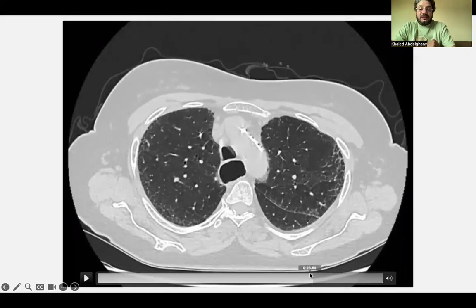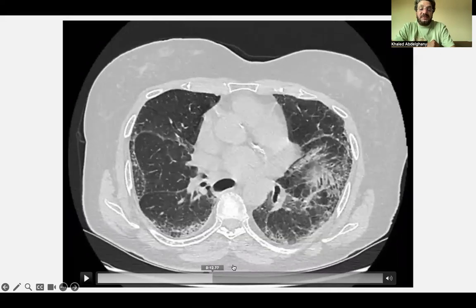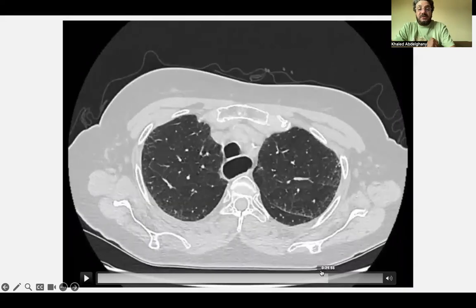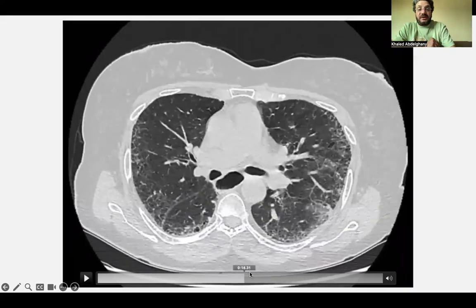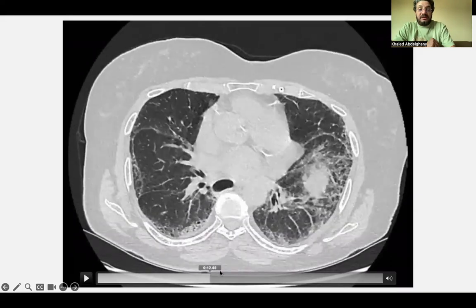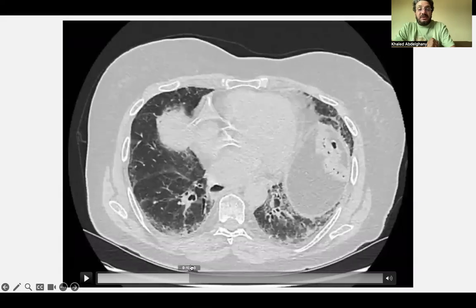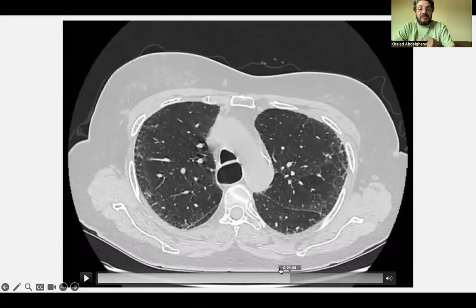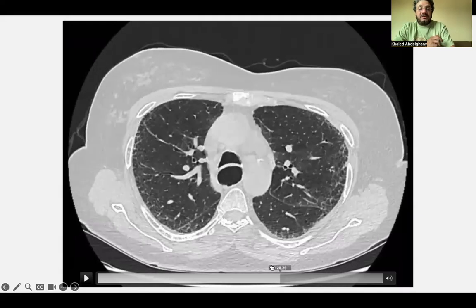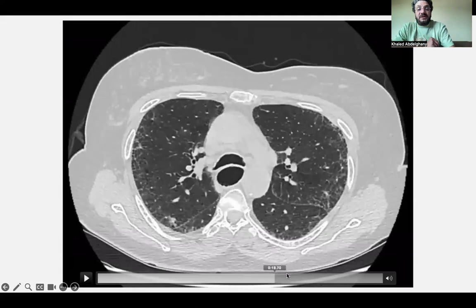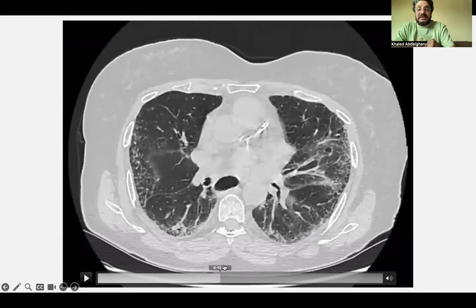We can expect that this patient has systemic sclerosis due to the dilated esophagus, which is obviously noted here. I intentionally did not include the age or history because I want to fix the patterns in the mind of radiologists listening, because interstitial lung disease, UIP, and other entities are not so hard to diagnose. I ask you to always request clinical information, but here we have a teaching session to fix the patterns.